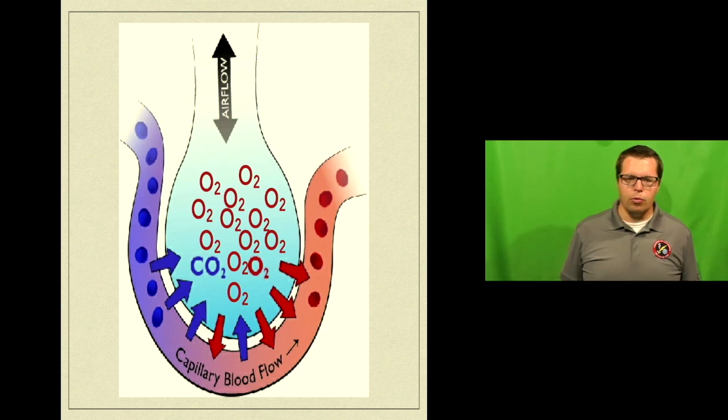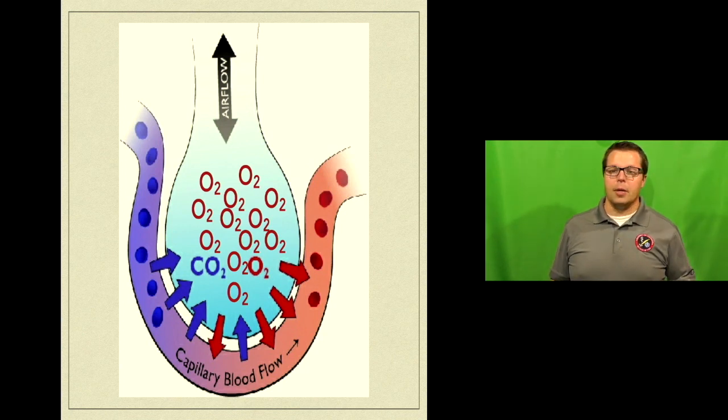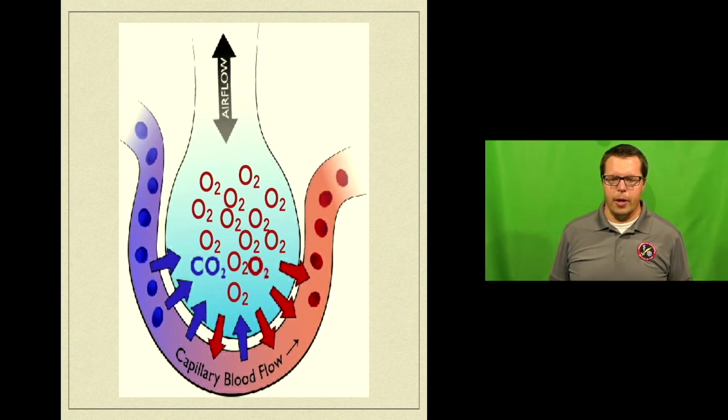So it's sort of a brute force thing. You reach the point of diminishing returns pretty quickly on that one in terms of the concentration of oxygen. But say the patient's SpO2 is still low. Their sat's still 80%, even on 100% fraction of inspired oxygen, FiO2. What do you do then?